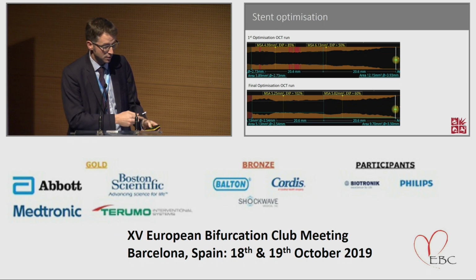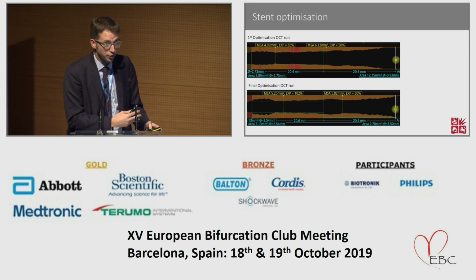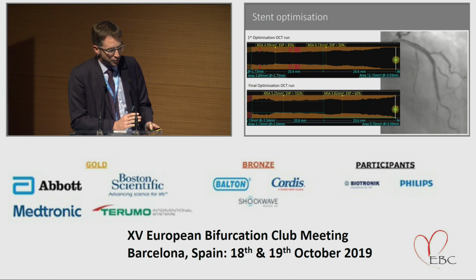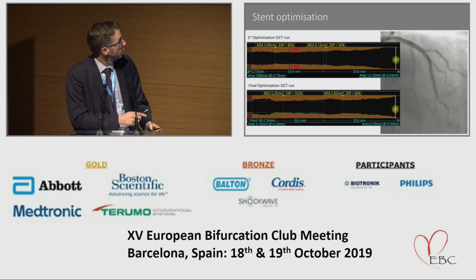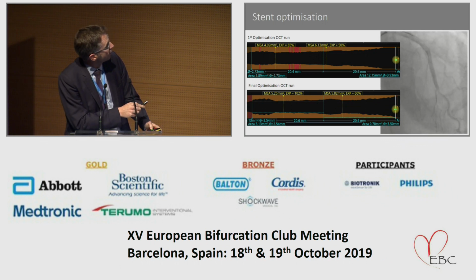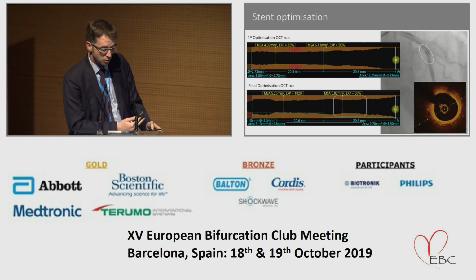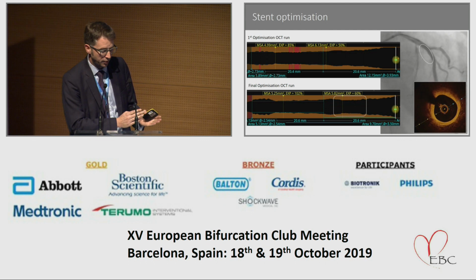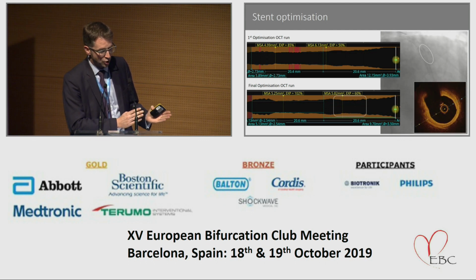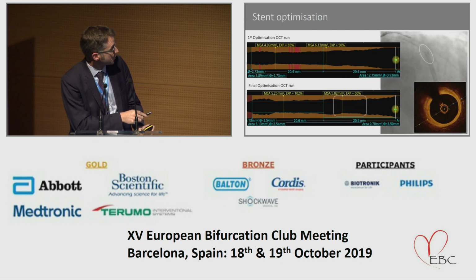The reality is that if you focus too hard on this, you could be there all day, ballooning after ballooning after ballooning. So actually from an angiographic perspective, it's reasonable. Although I'm drawn particularly to this area related to the second diagonal, which leads you then to go back and look at the OCT, and this would be interesting in terms of the discussions we've had about the bifurcation omics and the use of the data, because there isn't circumferential calcium here.